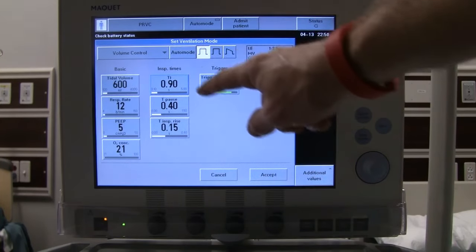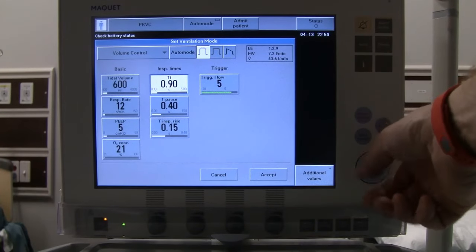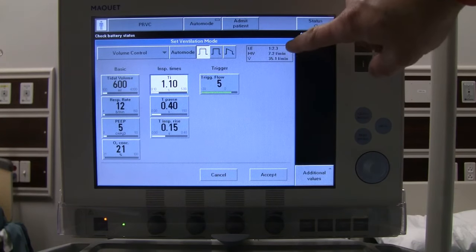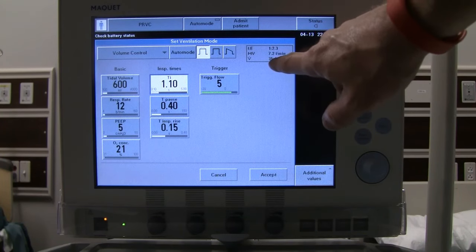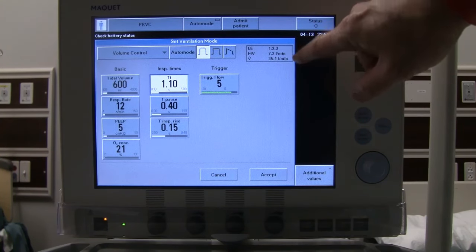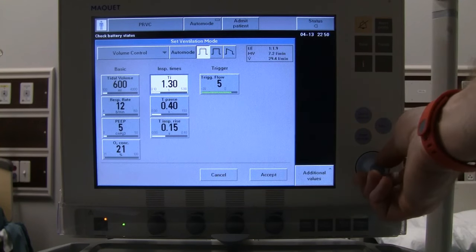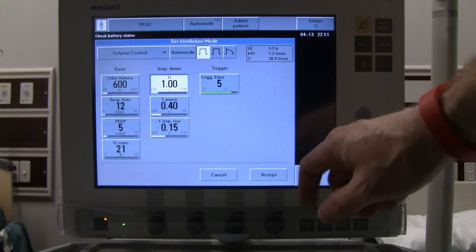We also have an I-time we can set here. As we adjust it, a small box in the top right updates to show our I-to-E ratio. There's also a minute ventilation based on rate and volume, and a flow setting. At facilities where flow is documented, you set your I-time and then read the flow from here. We'll set I-time at 1, which gives us a 1-to-2.6 I-to-E ratio.